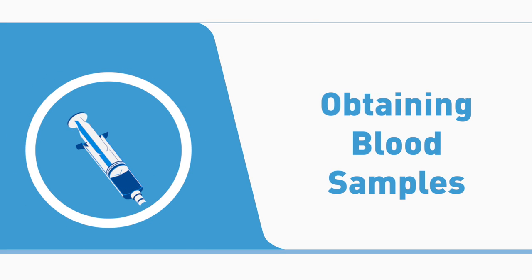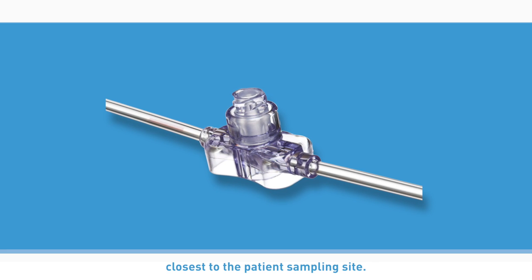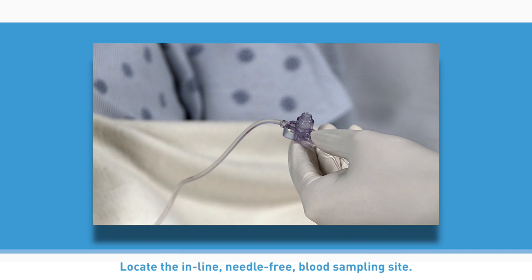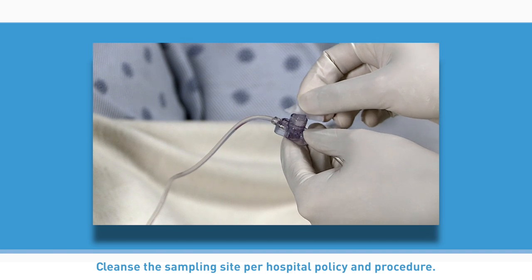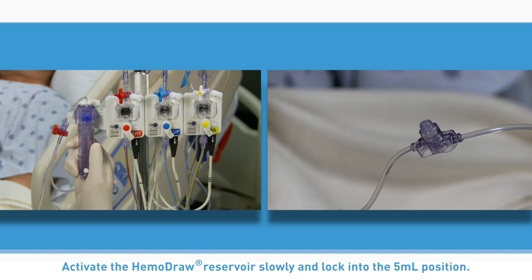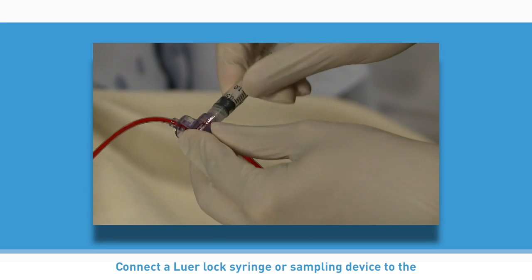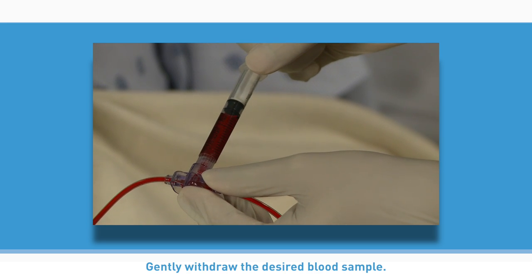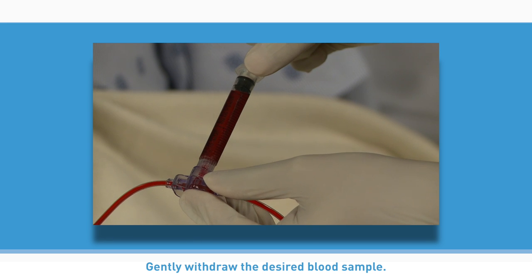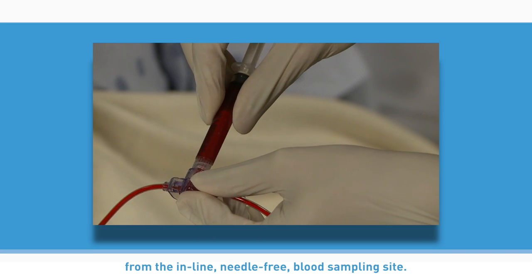Obtaining blood samples. For withdrawing a blood sample from the proximal — closest to the patient — sampling site: locate the inline needle-free blood sampling site. Cleanse the sampling site per hospital policy and procedure. Activate the Hemodraw reservoir slowly and lock into the 5 milliliter position. Connect a luer lock syringe or sampling device to the inline needle-free blood sampling site. Gently withdraw the desired blood sample. Disconnect the luer lock syringe or sampling device from the inline needle-free blood sampling site.